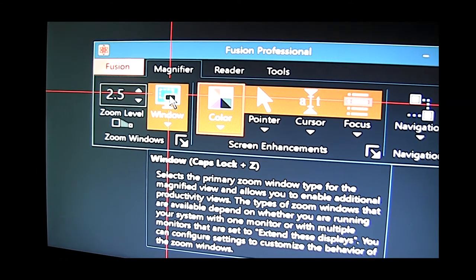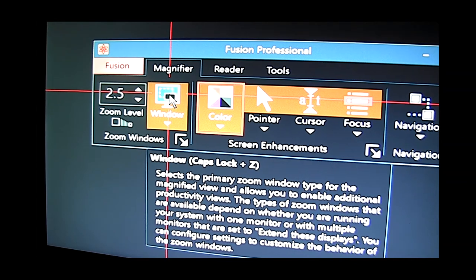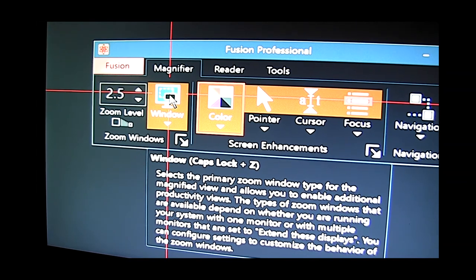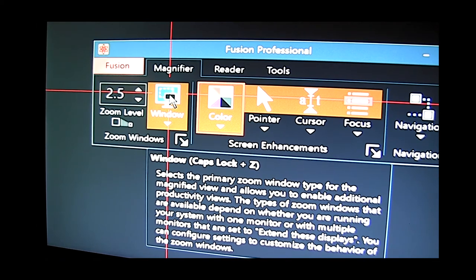So these are some of the magnification features in the ZoomText and in another section we'll be talking more about the advanced speech features that you can use with the JAWS program.